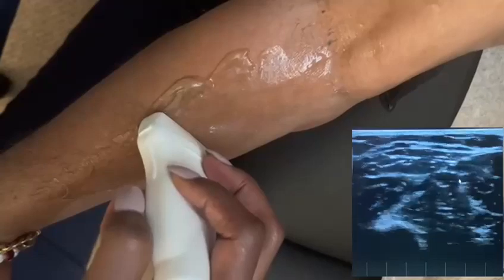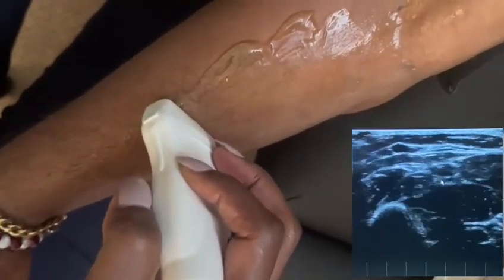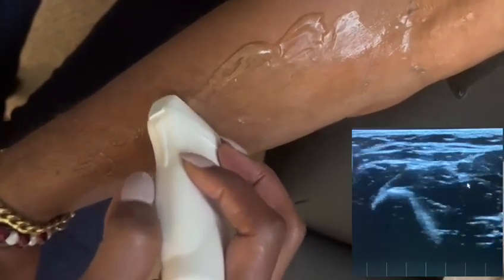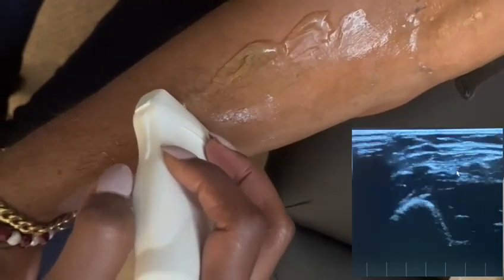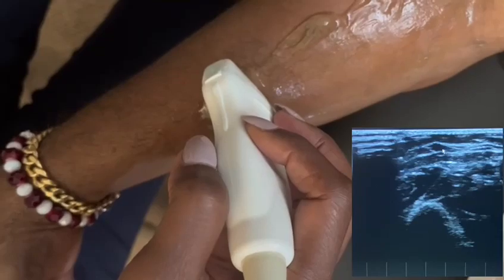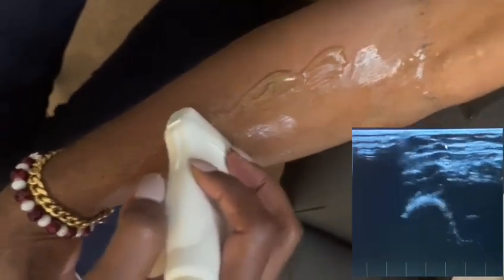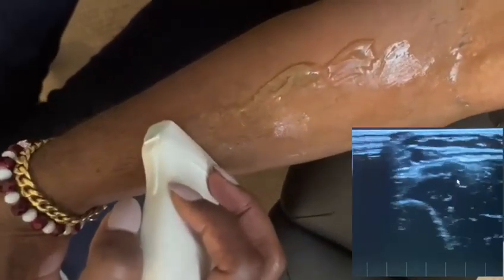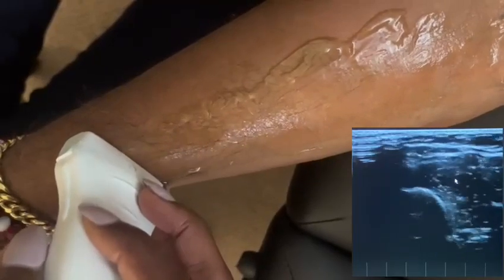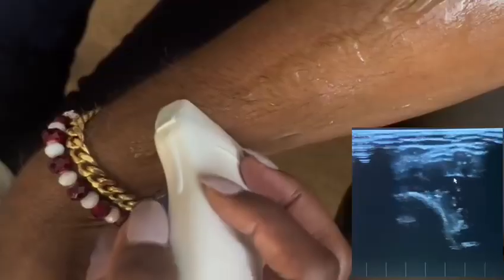Following the radial vein down as much as I can — it gets really tiny, but you can still see that vein right there, winking at you. You can follow it to the wrist. You can also see the cephalic vein, very superficial. I know it's the cephalic because I do not see an artery next to it. The radial veins and artery are paired — two veins and one artery — all the way down to the wrist.